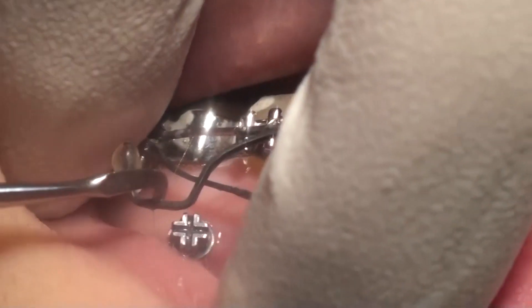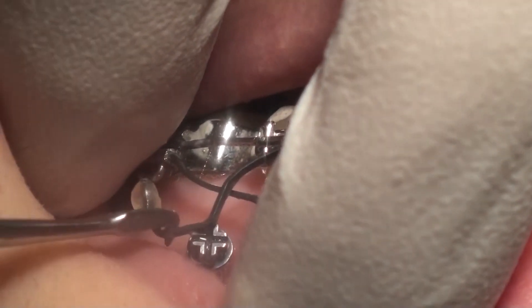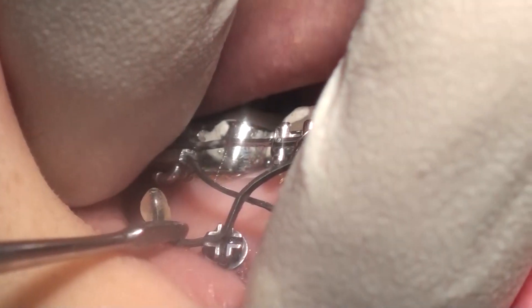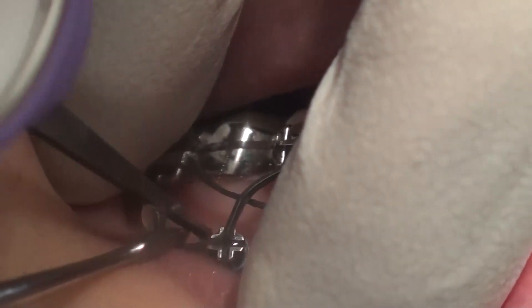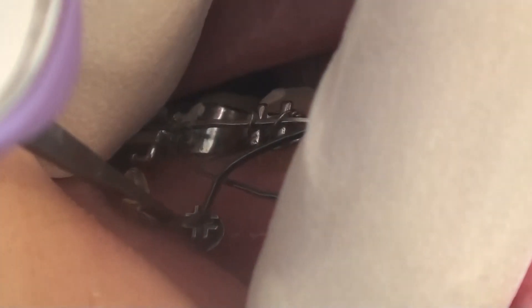It is the same thing that you can see in the lower — the same kind of wire, which is beta titanium 17 by 25, and the same system. Here you see that we are measuring the force, and the force is around 80 grams per side.